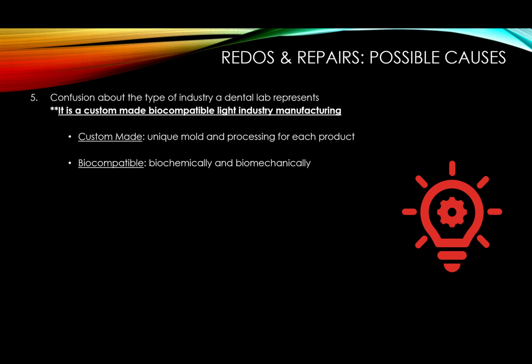But anyway, you have to realize that this goes in the patient mouth. There's an intraoral cavity. Is this compatible with the patient mouth? Is it going to cause allergies? Is it poisonous? And it comes in many forms. What kind of flux do you use? What kind of metal do you use? How do you polish the metal? How do you polish the porcelain? How do you glaze? You realize that this goes in the patient mouth, you know.